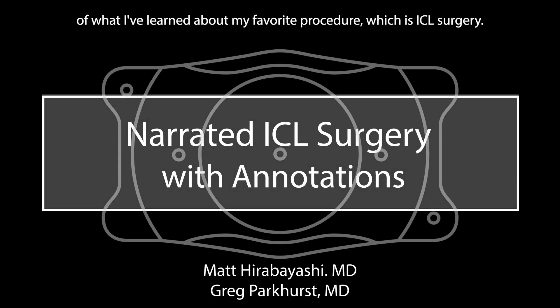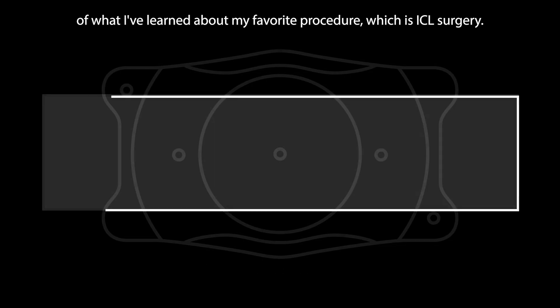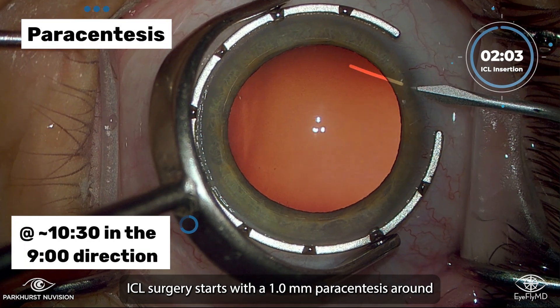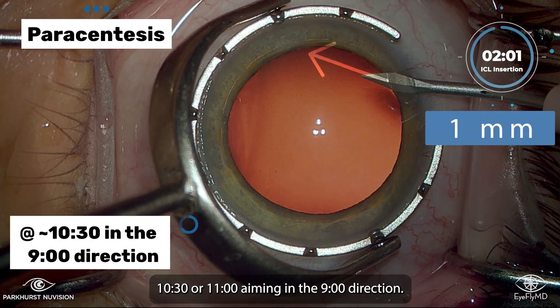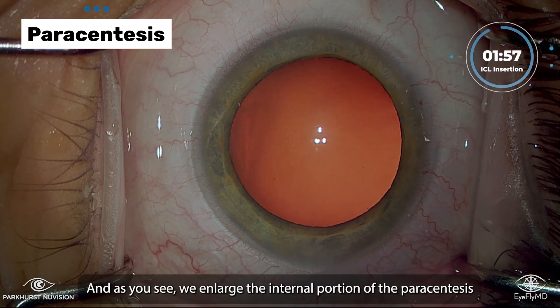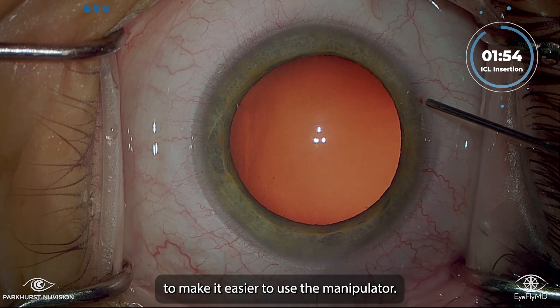I'm so excited to share some of what I've learned about my favorite procedure, which is ICL surgery. ICL surgery starts with a 1mm paracentesis around 10:30 or 11, aiming in the 9 o'clock direction. As you see, we enlarge the internal portion of the paracentesis to make it easier to use the manipulator.